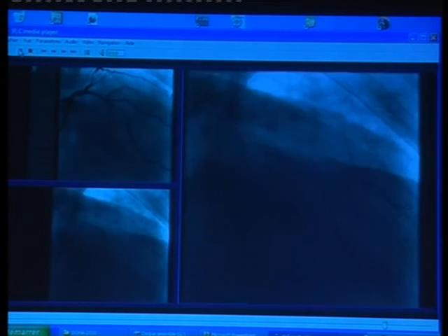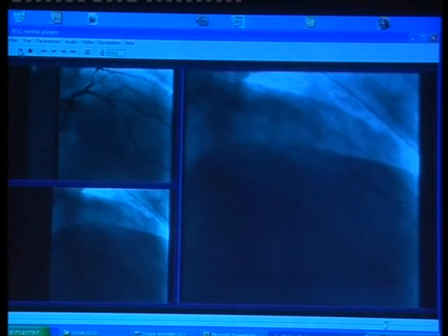At this point, I think we will do another angio in two orthogonal views. Who has a stent boost? Wonderful, because stent boost is available today only in the Philips machines. Yeah, it's a Philips machine. I think that GE or Siemens are also working on a similar system.